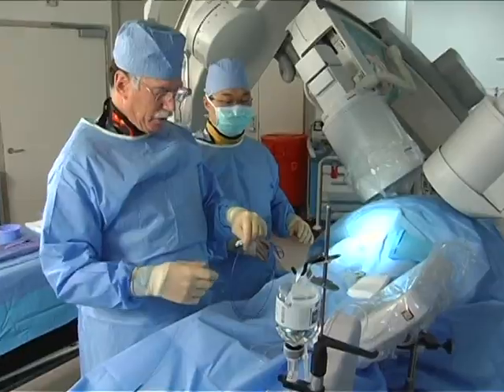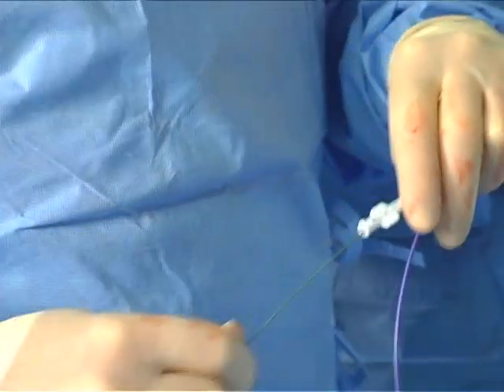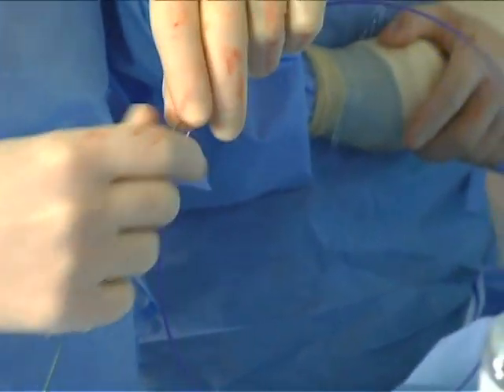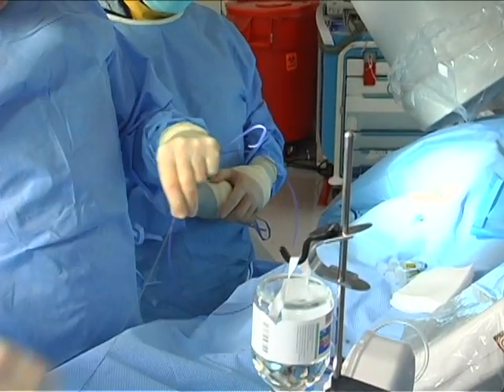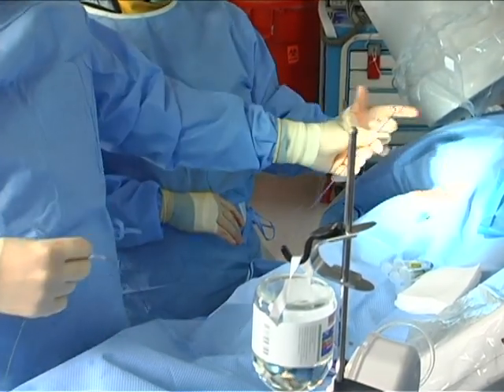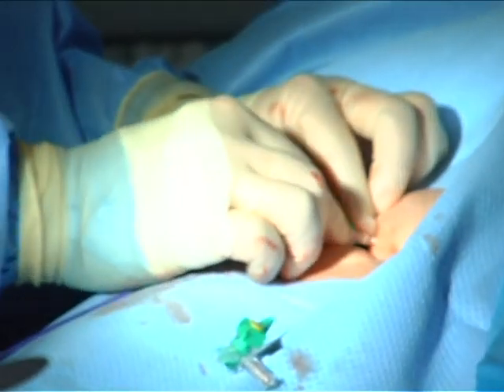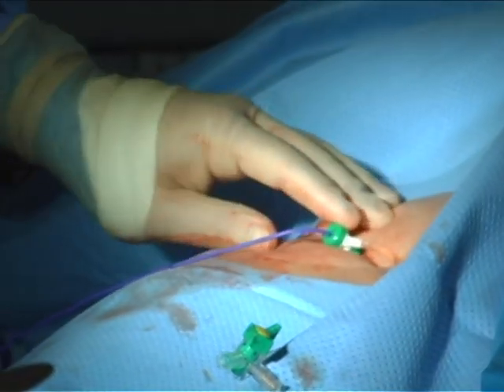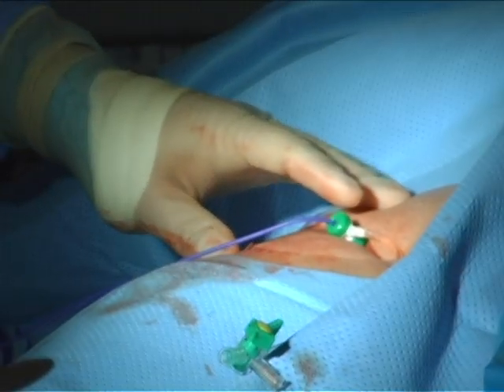Okay, here we go. What you can see is we're introducing our guide wire to our catheter, and then we'll get it almost to the very end like that. We'll introduce it into the sheath here. Okay, let's just do it like we regularly do. Okay, wire's up, left Judkins up, and we're now moving up the aorta.